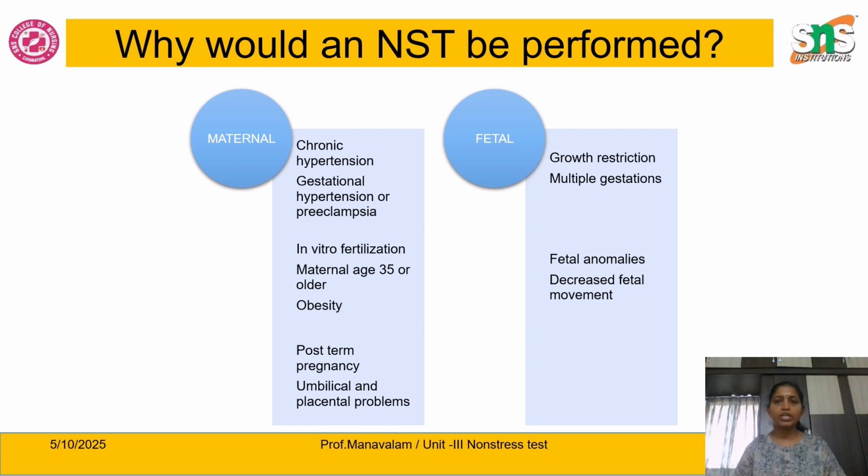Why do we have to do the NST? There may be a maternal indication and a fetal indication. But in the present scenario, for every mother after 28 weeks of pregnancy, clinically most probably after 32 weeks, they are doing the NST per month. Apart from that, certain indications also exist.